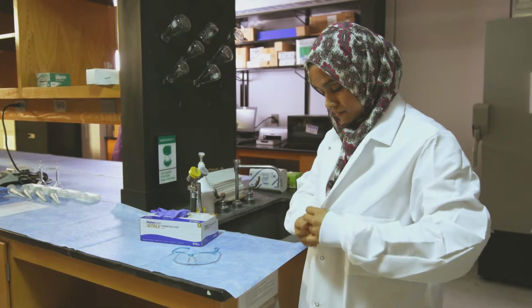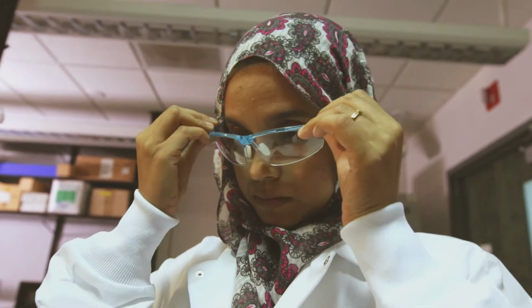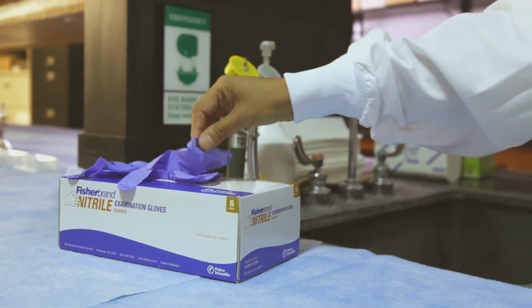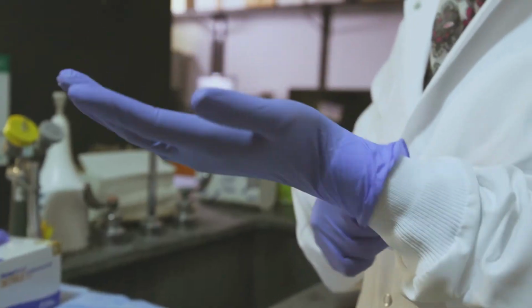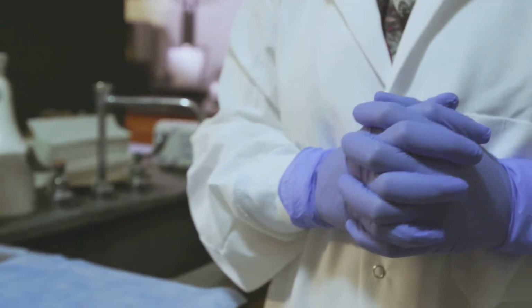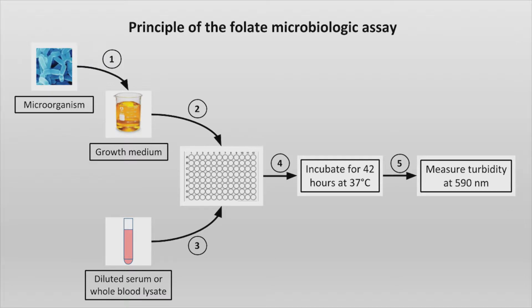Before we move on, please remember to consider all biological specimens to be potentially infectious. Therefore, it's critical that you observe universal precautions, wear appropriate personal protective equipment, and follow good laboratory practices when handling chemicals. Let's first review the principle of the folate microbiologic assay.